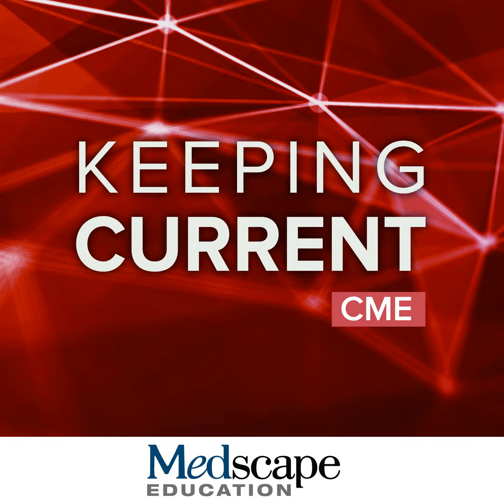Now, big picture, why do we care about this, and why is this changing? Well, for a long time, what we focused on in terms of Alzheimer imaging was that end stage of the disease. So we would look for patterns of atrophy. And you can see here as an example of what a brain with Alzheimer's looks like at the end stage. This is an autopsy. Very widespread atrophy, but in particular, atrophy of the hippocampus and the temporal lobe, and ex vacuo dilatation of the lateral ventricles. And of course, we've known about this since the dawn of MRI.